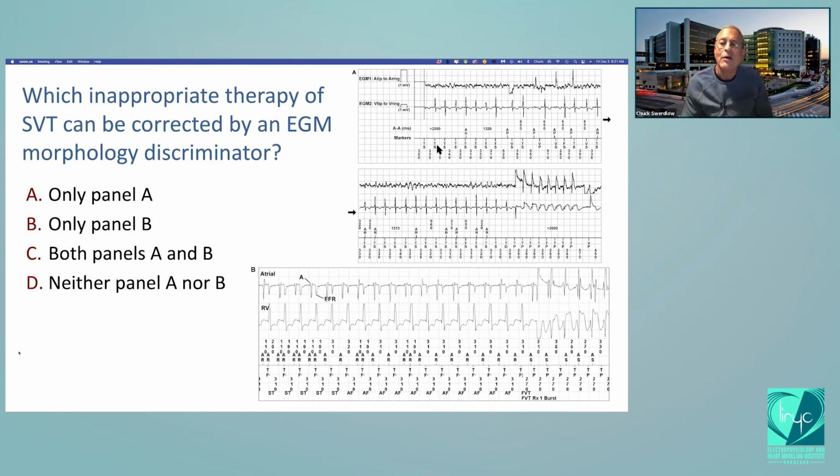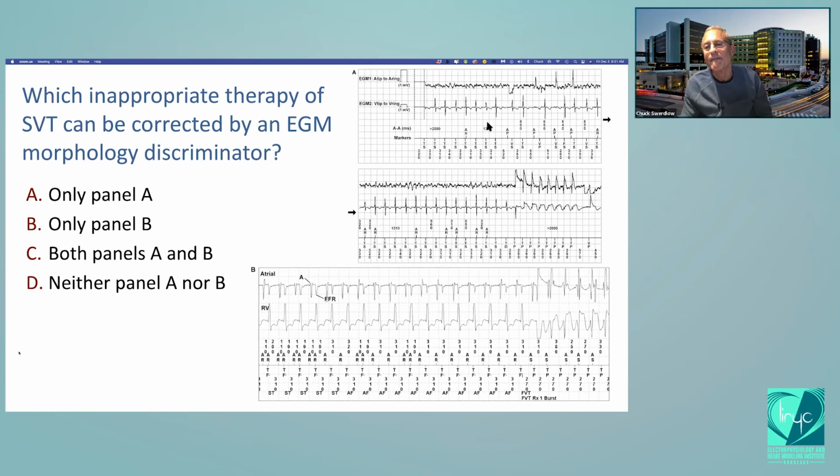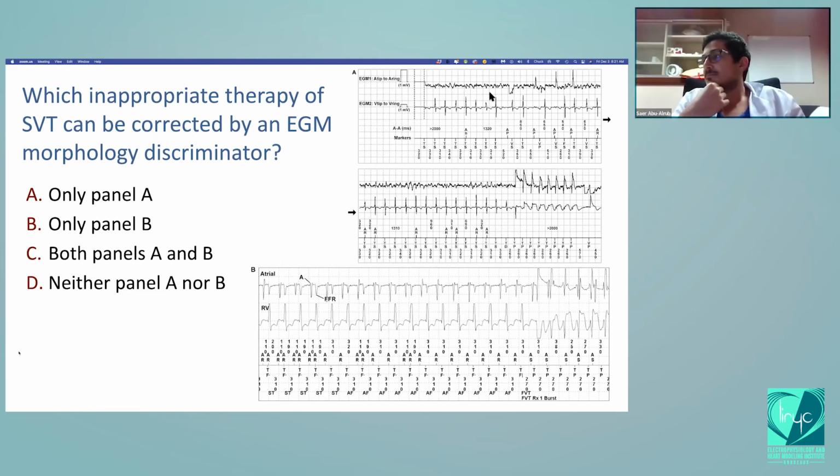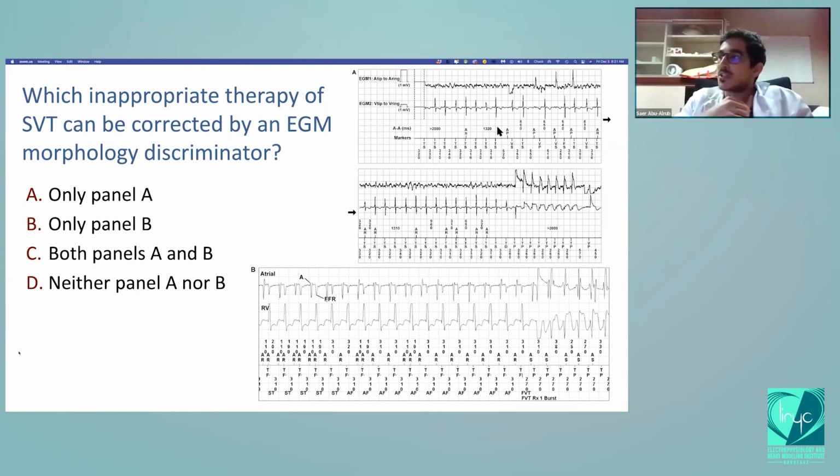How does the defibrillator classify this rhythm? A greater than V, V greater than A, or A equal V? More V than A. Really there are more A's than V's, but the defibrillator says more V's than A's. What does a defibrillator do when it sees more V's than A's? It goes directly to a diagnosis of VT.